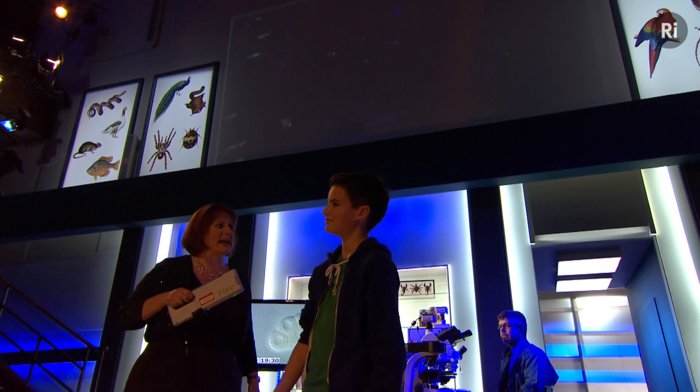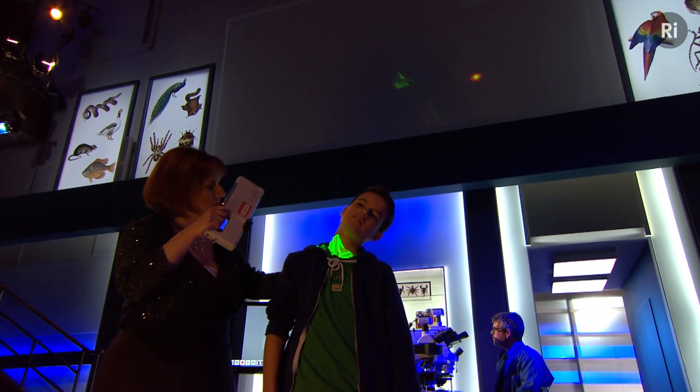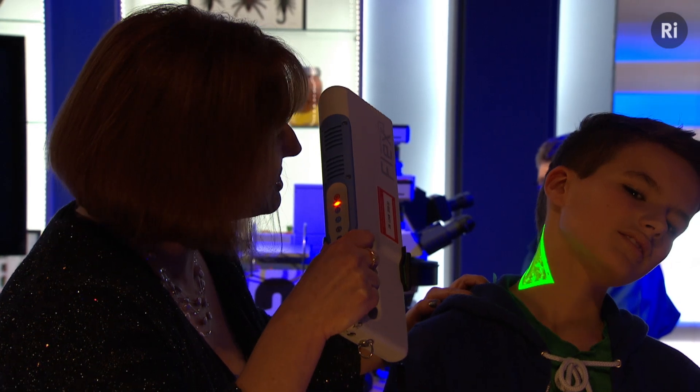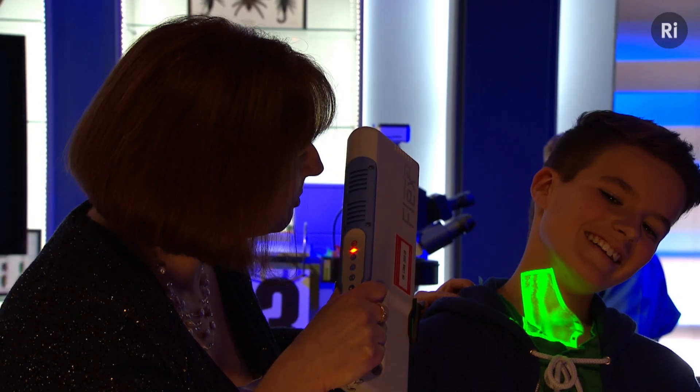Shall we see if you've got any veins in your neck? You should have. Let's check. There we are. Wow, you've got some big veins there. Obviously, a very oxygenated young man. Brilliant. I think I might take this home with me. Is that all right?